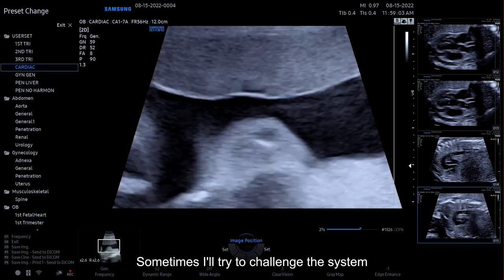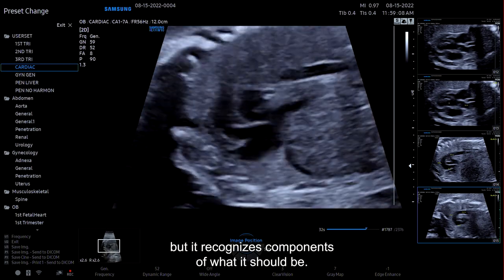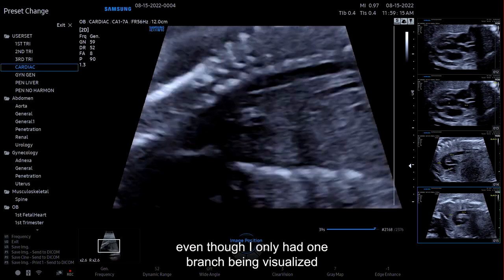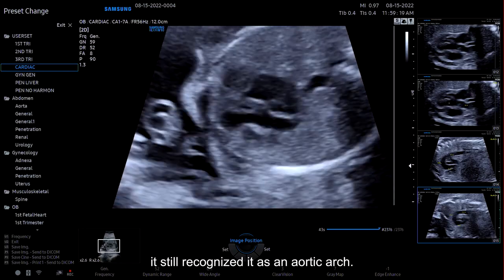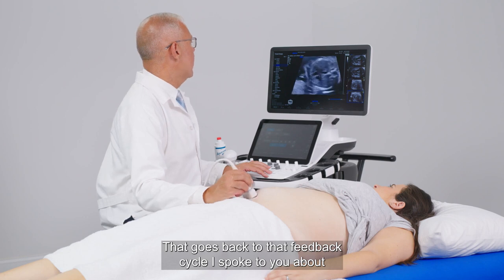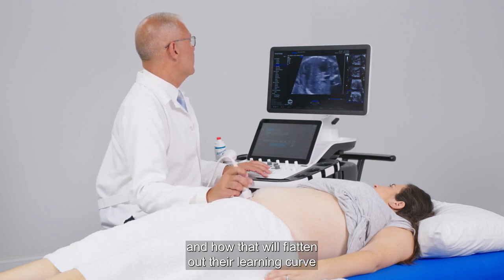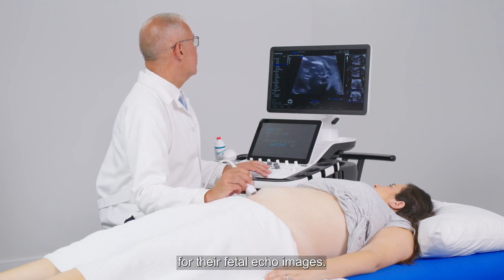Sometimes I'll try to challenge the system and give it an image that looks like another image, but it recognizes components of what it should be. So a perfect example was that aortic arch. Even though I only had one branch being visualized, it still recognized it as an aortic arch. That goes back to that feedback cycle I spoke to you about and the importance of that, particularly when someone's learning, and how that will flatten out their learning curve and improve their ability to get the images that they want for their fetal echo images.